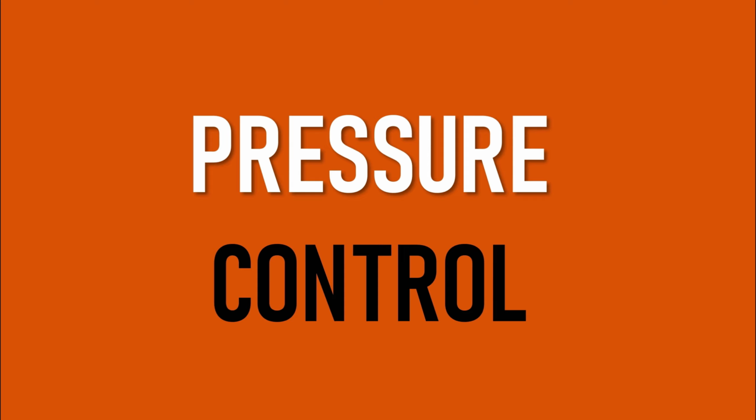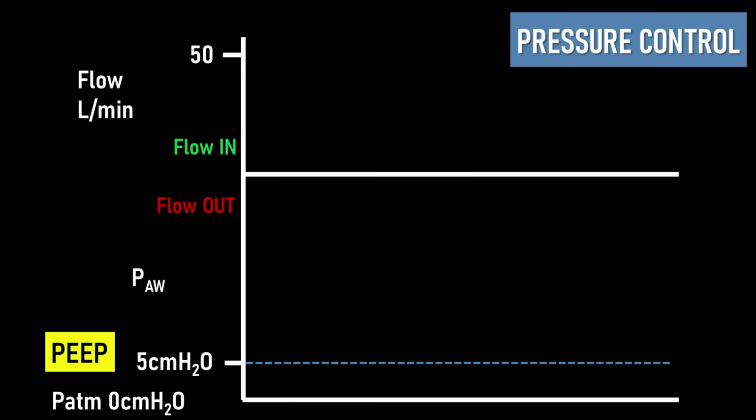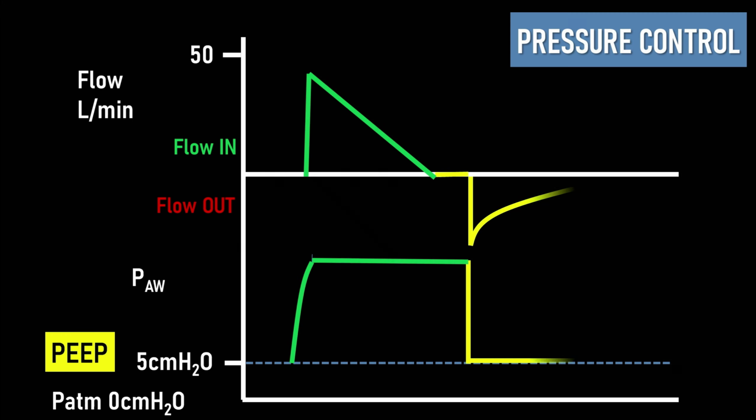And this is a very, very straightforward and simple mode of ventilation. In this case, the ventilator intermittently gives a patient a breath that is targeted at a specific inspiratory pressure level, whether the patient takes a breath themselves or whether it's a mandatory breath. It's always the same airway pressure. The gas flow is always decelerating because the ramp is greatest at the beginning of the breath, and as the airway pressure climbs, the flow slows down. So this is what pressure control looks like.